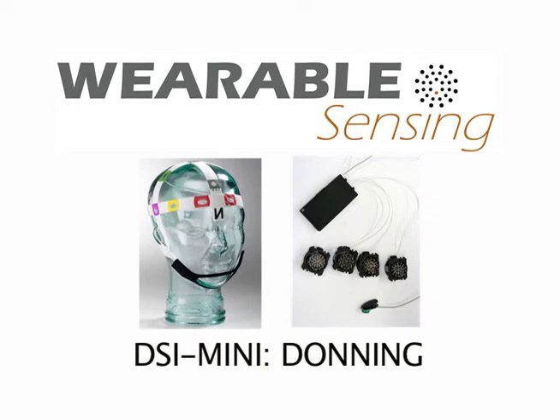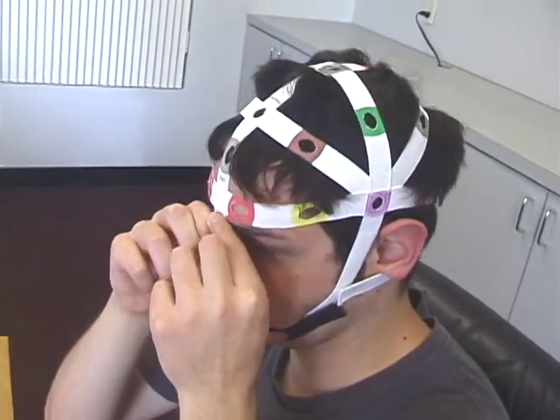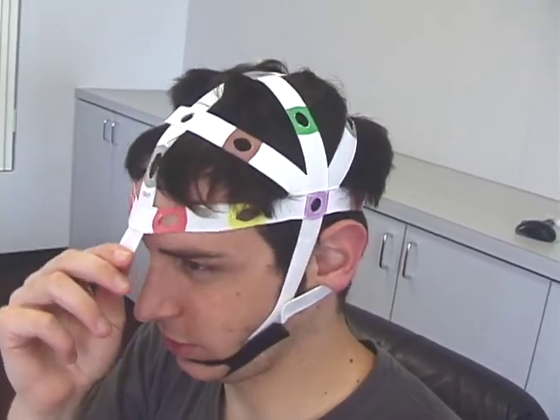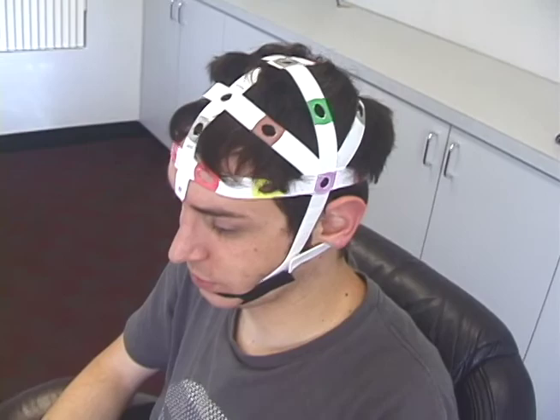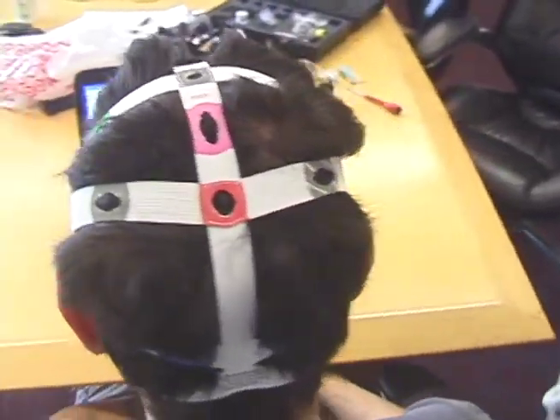This video shows the donning of the DSi-mini system. First, don a size-appropriate brain net and adjust its fiducial marker on the nasion. The brain net's color-coded locations will allow you to position and hold sensors at approximate 10-20 locations.